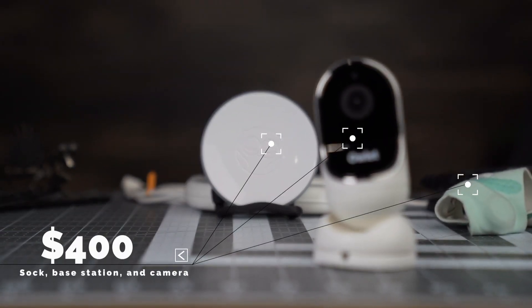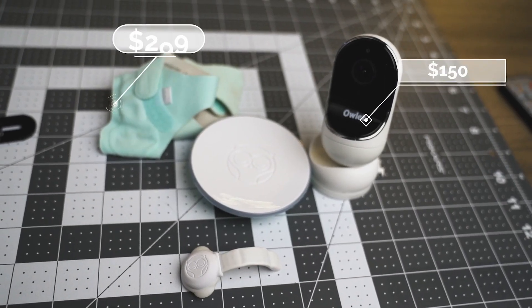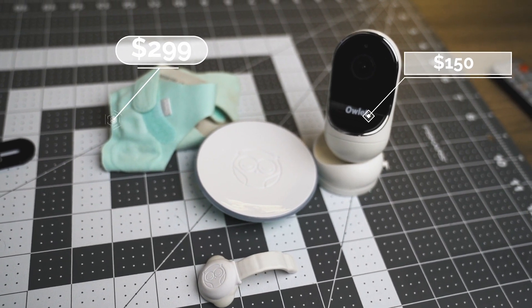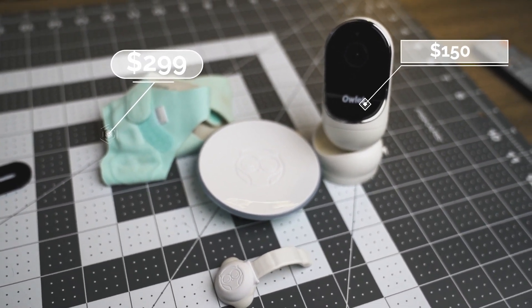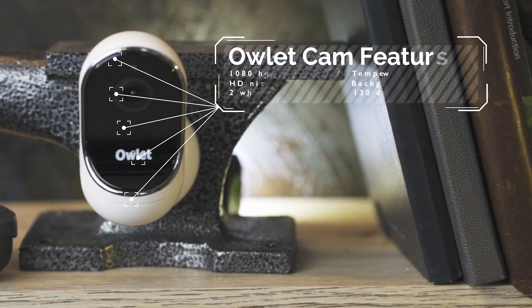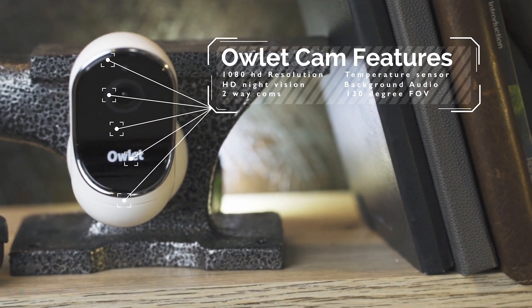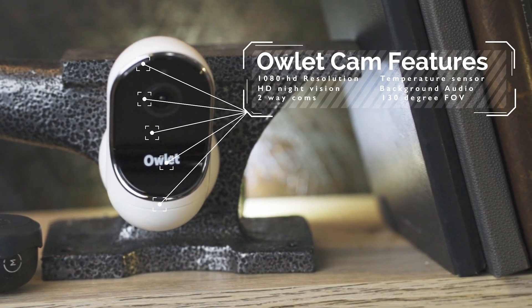You can bundle the Owlette sock and the Owlette Cam for $400. If you're not into bundling, the sock is around $299 and the camera alone comes in at $150. The camera streams video in 1080p HD, has HD night vision, background audio capabilities, two-way talk, a 130-degree field of view, pinch-to-zoom within the app, and a temperature sensor. It compares pretty evenly with other high-end monitors like the Nano Plus and the Miku.